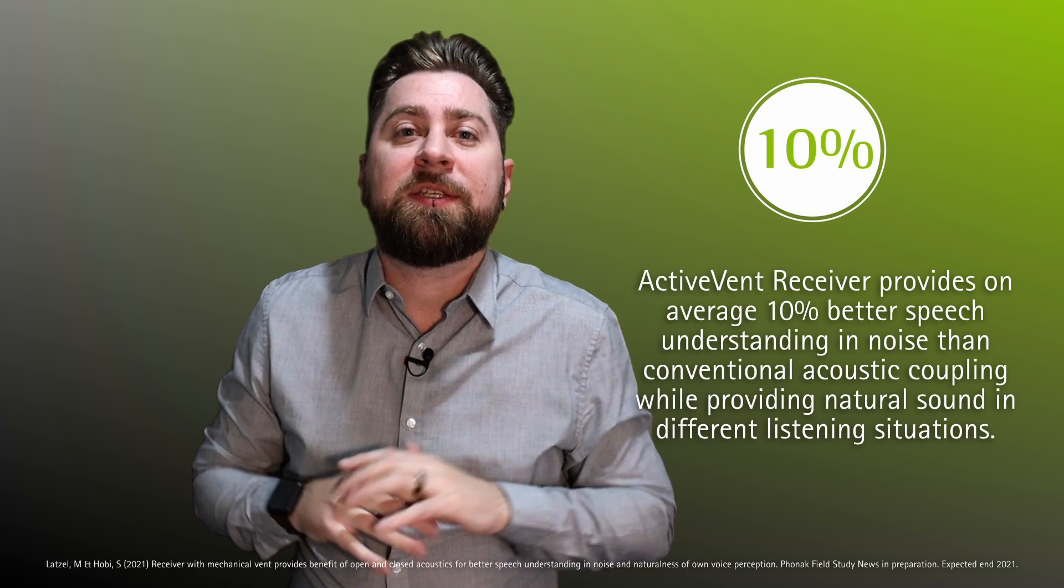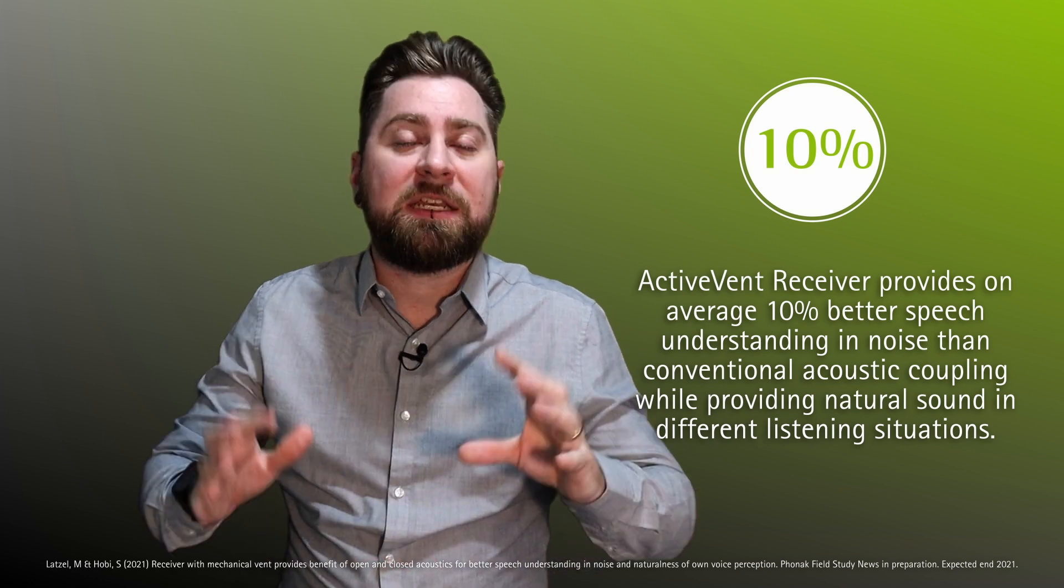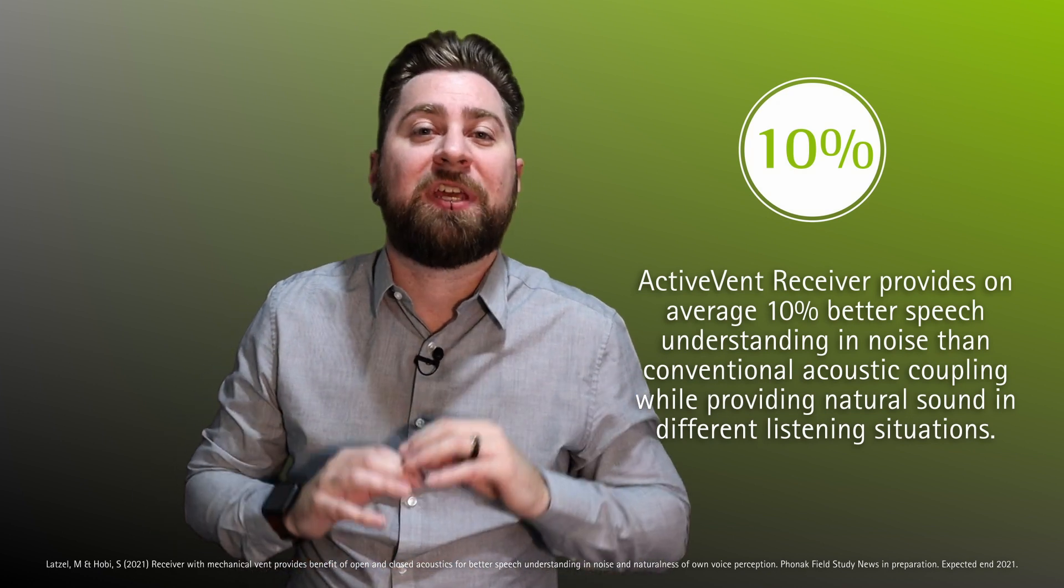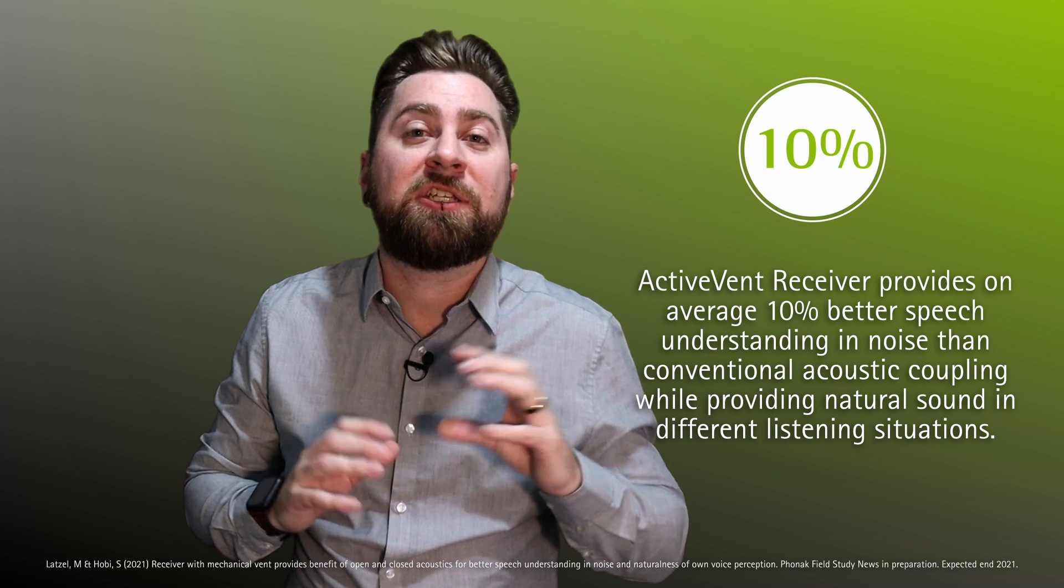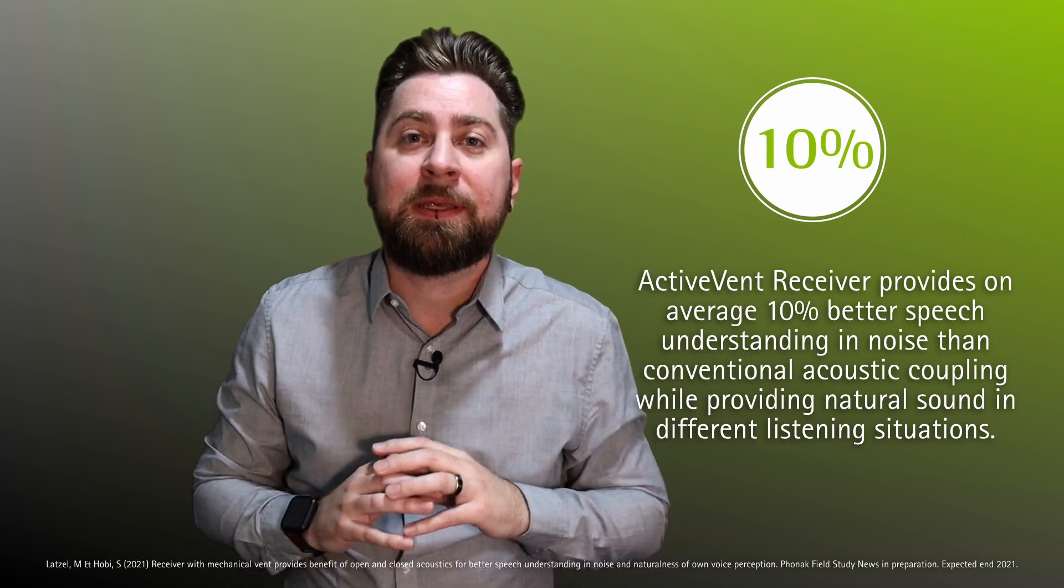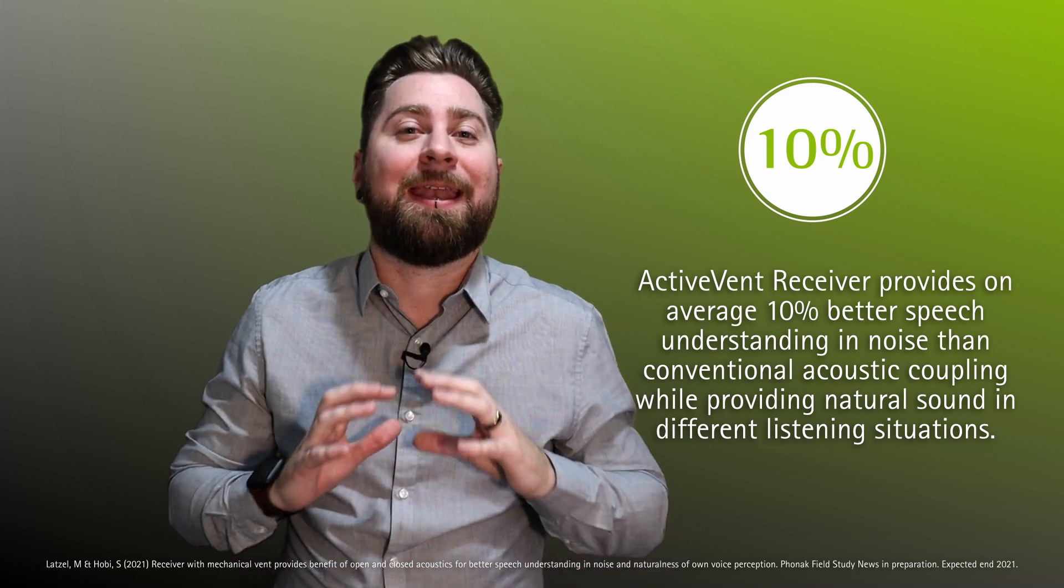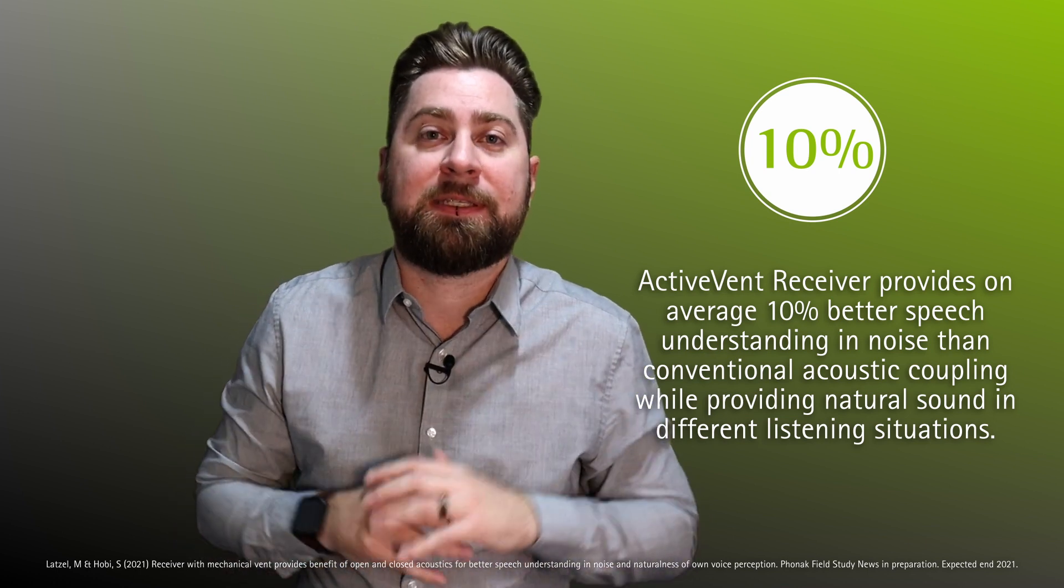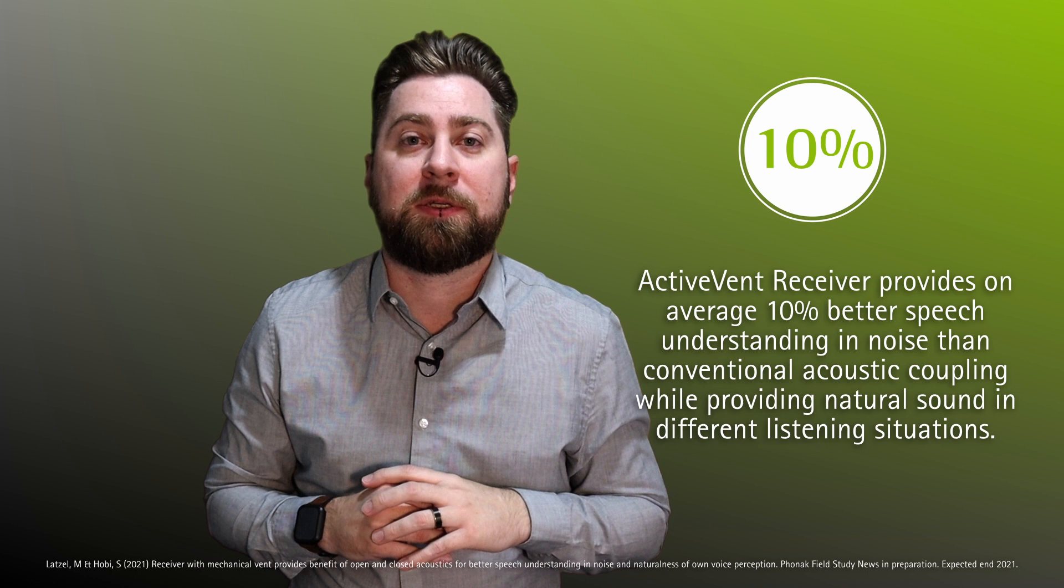Our research shows that ActiveVent receivers provide on average a 10% increase in speech understanding in noise while providing a natural sound experience in various listening situations.